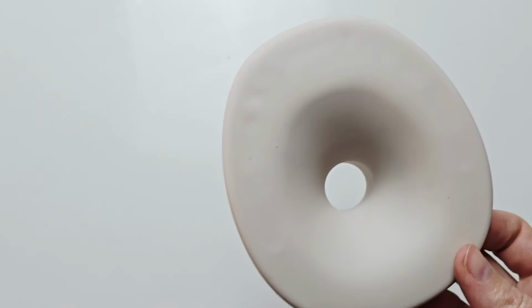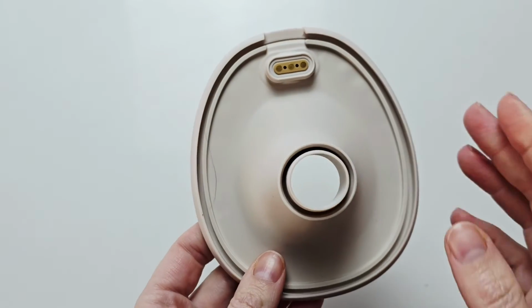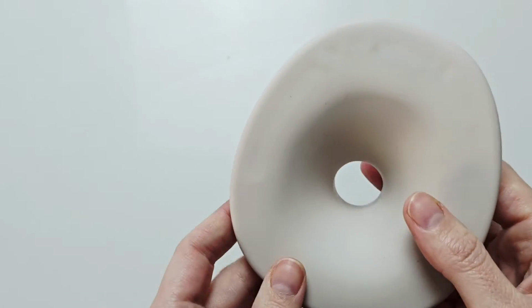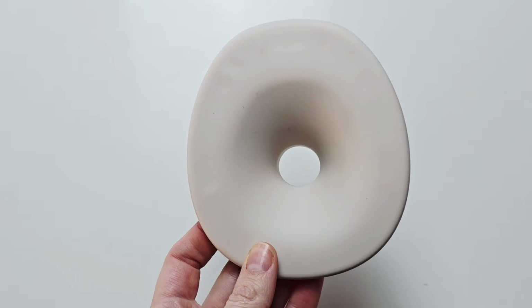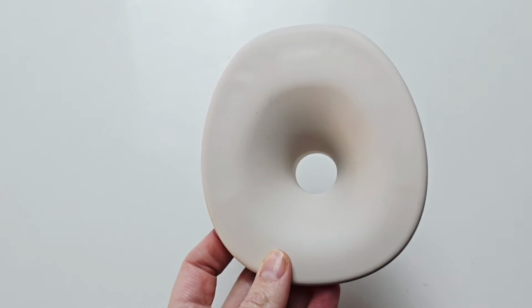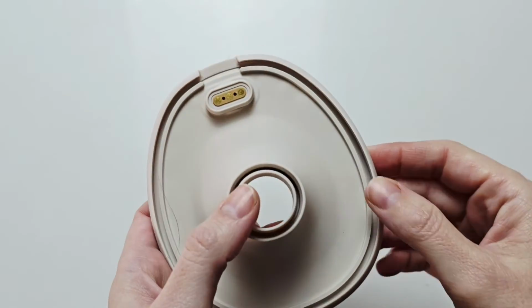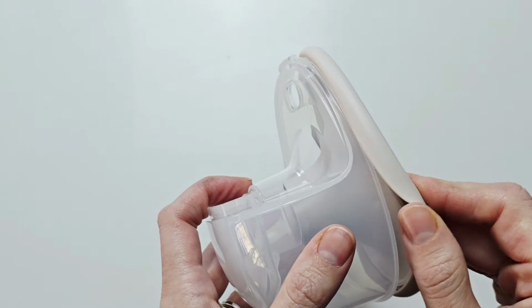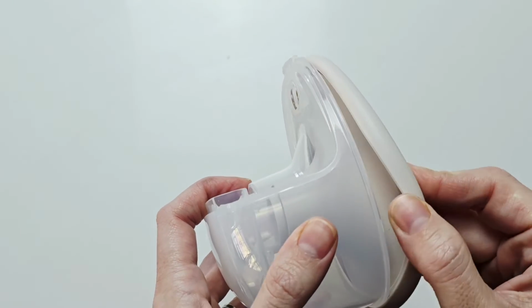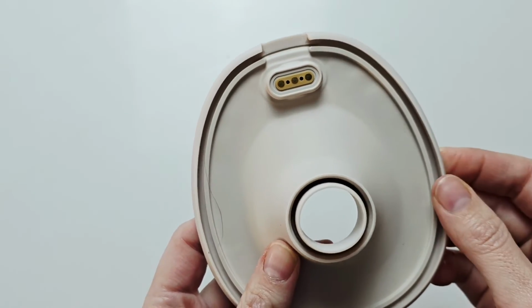Okay, then we have your flange. Now, Eufy recommend 3 to 4 months if you are using your pump 3 times or more a day, or 5 to 6 months if you're using it less than 3 times a day. You'll probably find 3 to 4 months is a good time to replace these. You can start getting wear and tear on these seals, especially as they have to get lifted up and over the edge of your collection cup. It's an easy spot for these to wear.